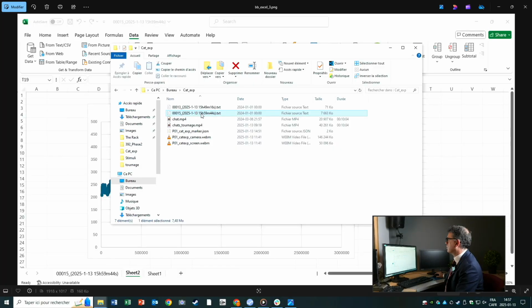So do that as a way to make sure that the data is correctly recorded on the device, and also to have some form of assurance that there is variance in the data you've collected. There are two files recorded on the micro SD card for every single recording on a Cobalt Blue Box. The two of them contain about the same information, but the second one is more usable. You want to look at the one that is a much larger file than the first one. In this case, we have almost an 8 megabyte file that contains all the data of the recording.